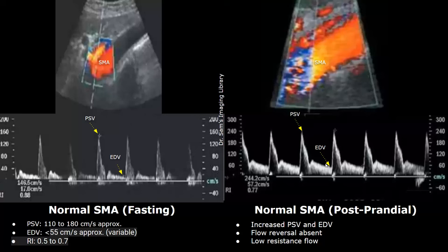In the post-prandial superior mesenteric artery, a low resistance flow will be seen on spectral Doppler. The PSV and EDV will be higher compared to the fasting state. In this image, the PSV is more than 240 centimeters per second and the EDV is approximately 60 centimeters per second. Flow reversal will also be absent after eating.